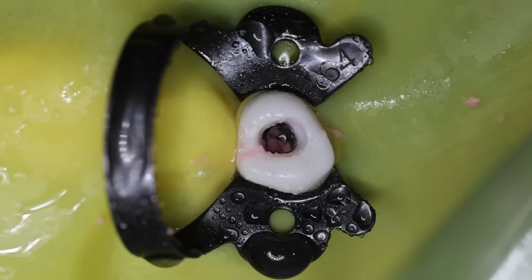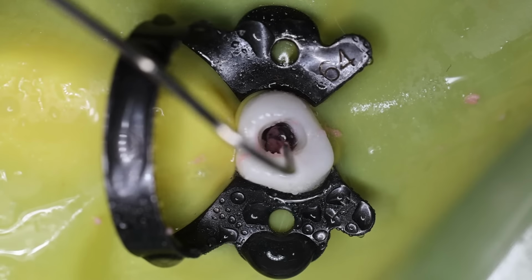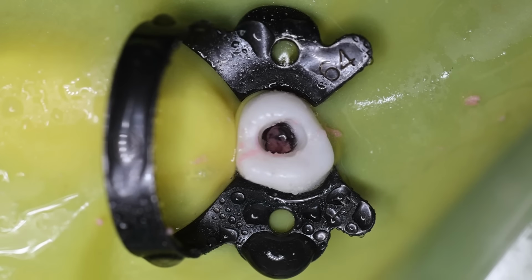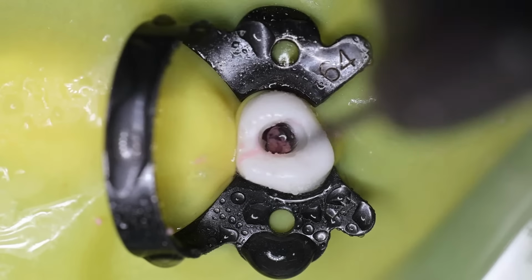In these types of cases it is very helpful that once you are using the endo Z bur, you can begin at the sides, these walls, so that you can enlarge your access cavity and easily visualize it. So this is the endo Z bur that we are going to use.